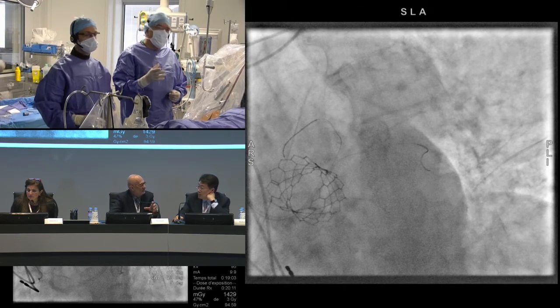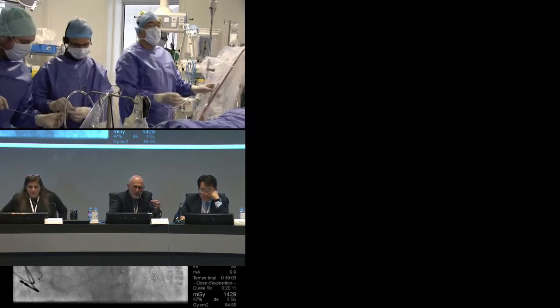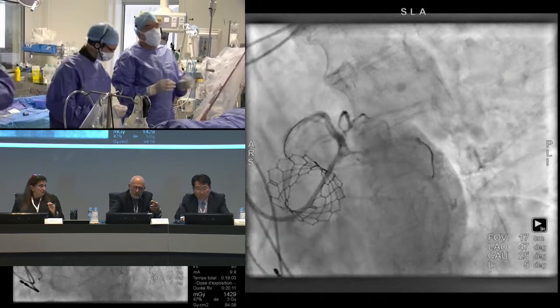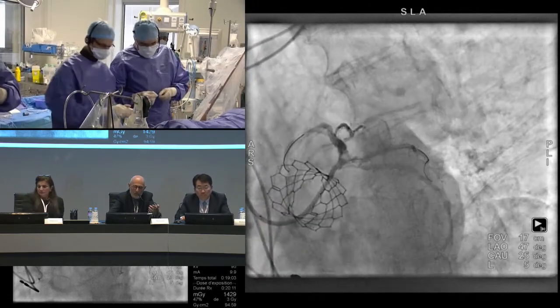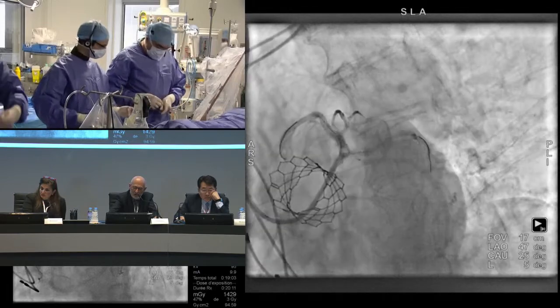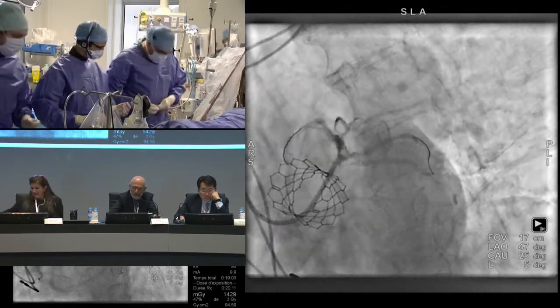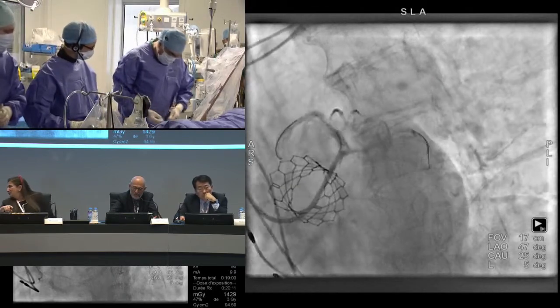Then we could postdilate, but at the beginning, when you look at the size of the distal, why not IVUS at this point? I mean, it can help you in characterizing the plaque, how to go in stenting, whether to distal circ or to marginal. Why not now, IVUS?